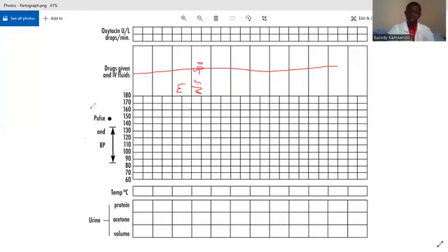So this particular part, again, you need to record the mother's pulse, the mother's blood pressure. You need to record it here, as well as the mother's temperature, which you need to record at this particular portion. So if you check the mother's blood pressure, let's say you have opened the Partograph at 6 centimeters, you follow the same boxes downwards as well as boxes up, that particular part we started from.